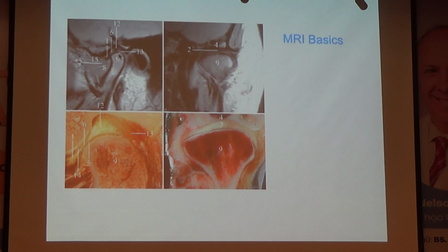The shape of the condyle, the meatus. So this is a very nice image. So if you have a TMD, this is the gold standard exam.